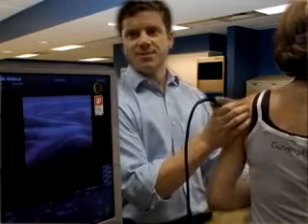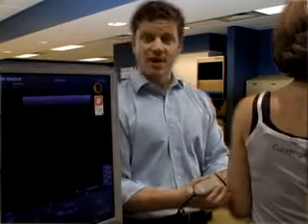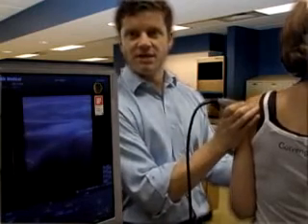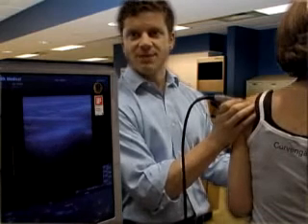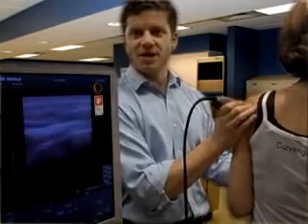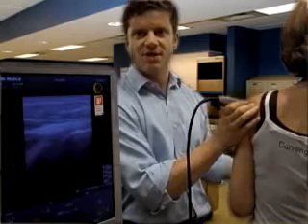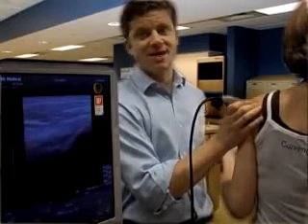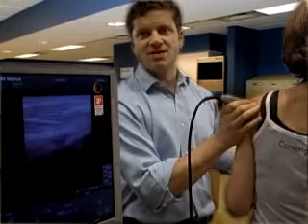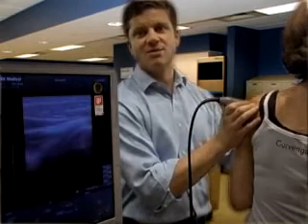Here's the anatomy that we're seeing. I'm going to have the patient keep the elbow next to the body, and I'm just going to grab their hand and ask them to dance — letting me take the lead. That's important because if you tell them to move their hand, their arm goes all over. What I want to do is visualize the humeral head, the infraspinatus, the glenoid, and the labrum. I'm rotating the humeral head by grabbing the hand of the patient and externally rotating with the elbow at the side.